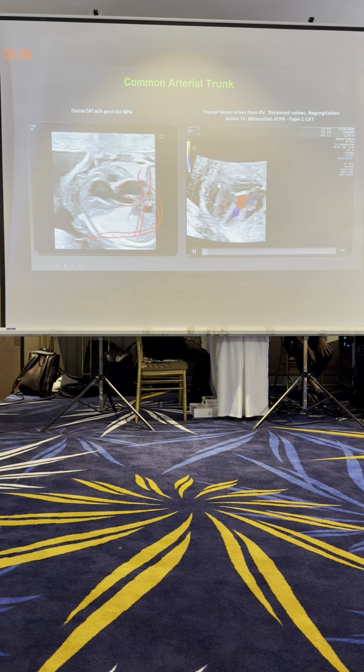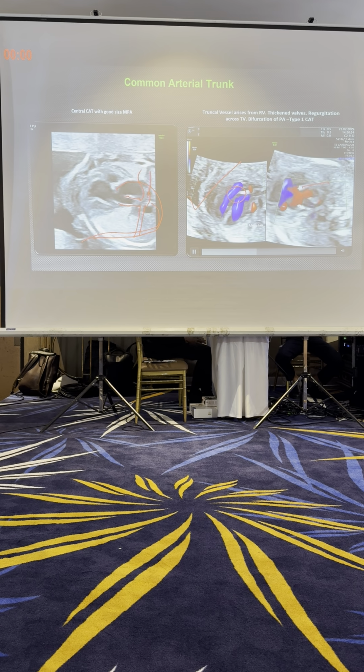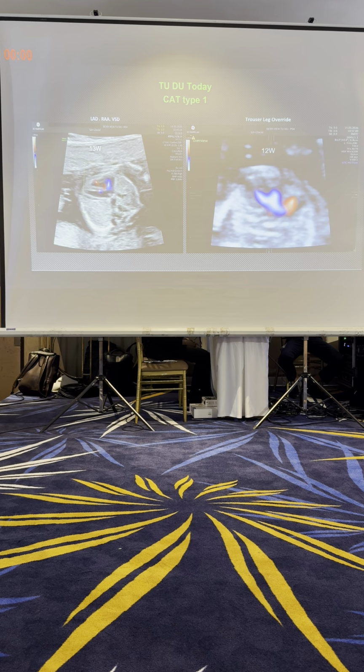And when you look with color Doppler, a normal four-chamber, VSD, and when you sweep from the left ventricular outflow tract, you can see the branch pulmonary artery coming off and getting off both vessels. This is a common arterial trunk, type 1. So that's the important differential diagnosis.